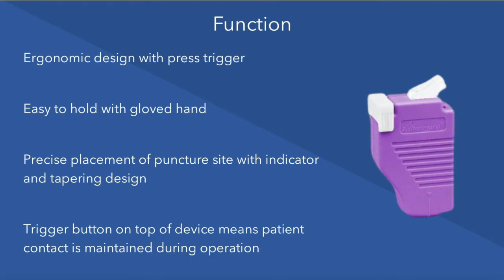The device incorporates an ergonomic design which is easy to hold in a gloved hand. It can be precisely placed on the puncture site with the indicator at the base of the device. The trigger button on the top of the device means that contact is maintained with the patient throughout the procedure.